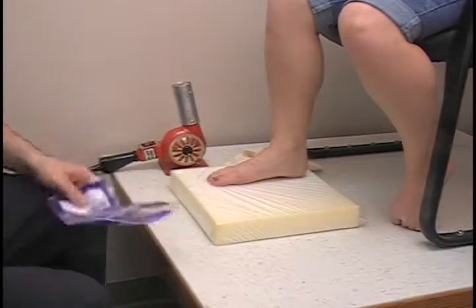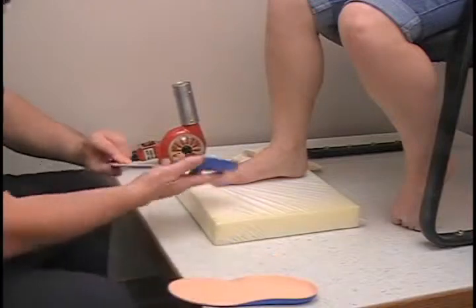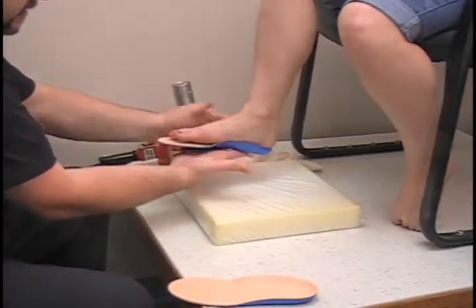You want to pull the 405 that is going to fit them best. Just make sure with a real quick fit — it looks like that is going to fit pretty well.